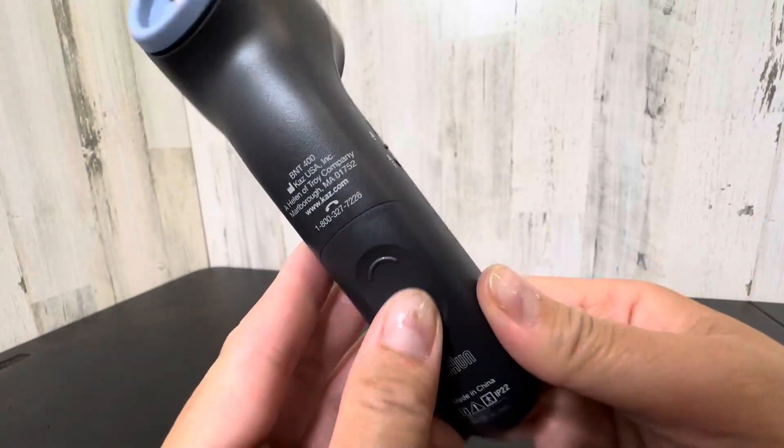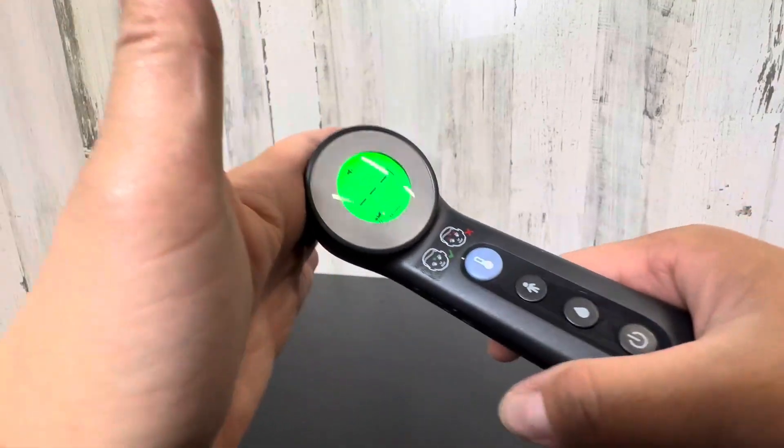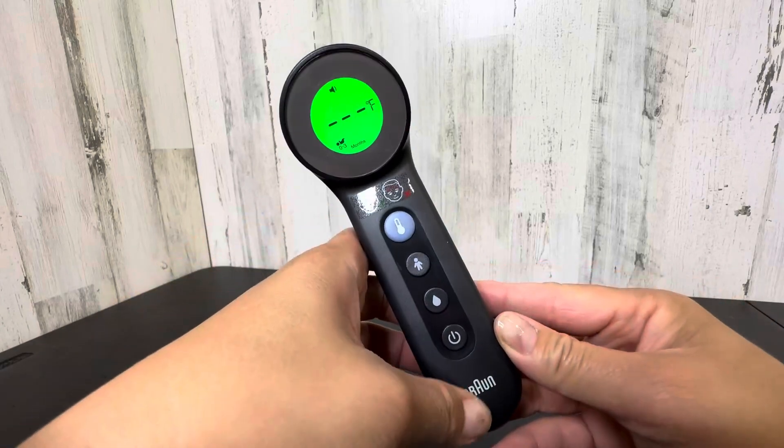It is powered by two AAA batteries — really solid thermometer, high quality. I highly recommend this as a nurse.